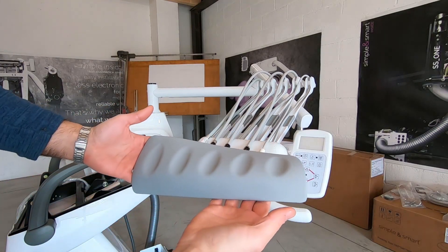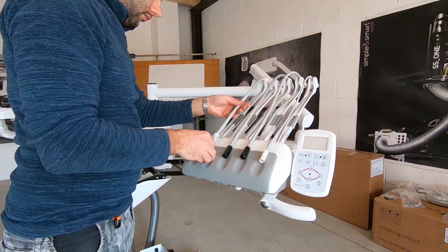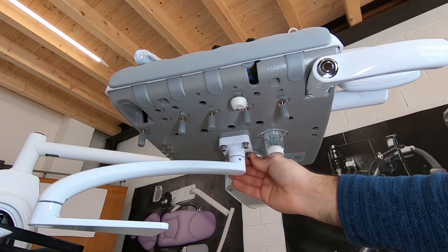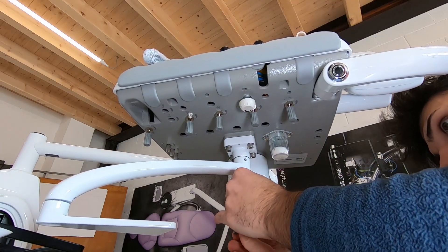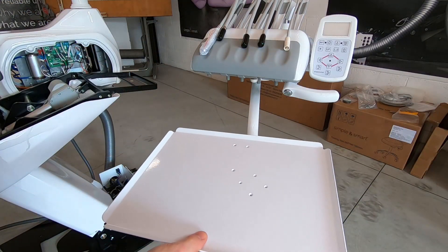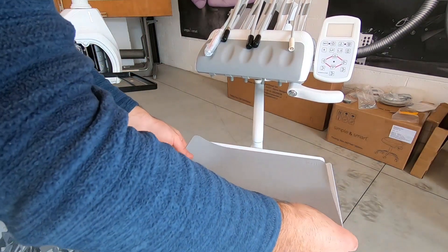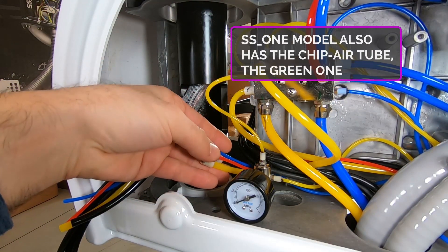Mount the silicone pad. Install the arm tray and the tray. Put its silicone on it. Connect the 4 pipes in the water unit respecting the colors.